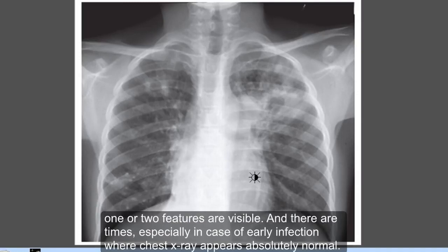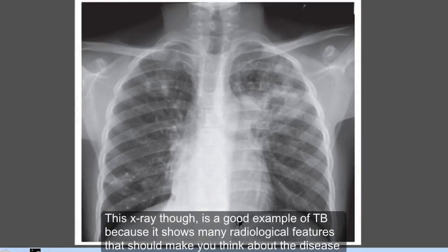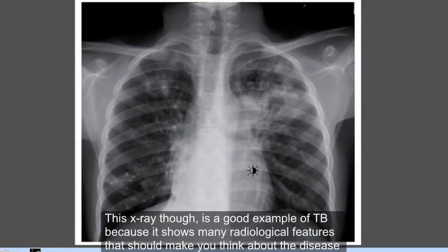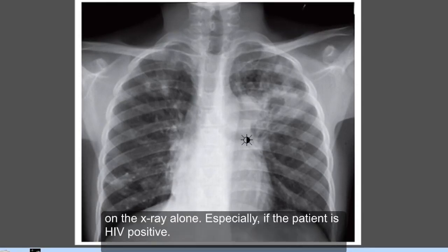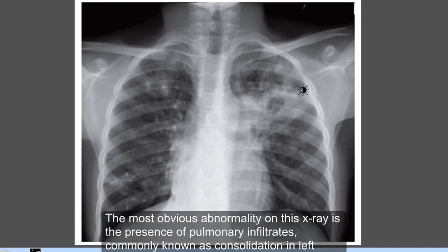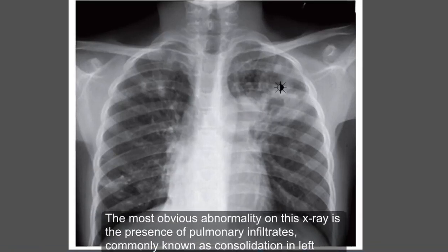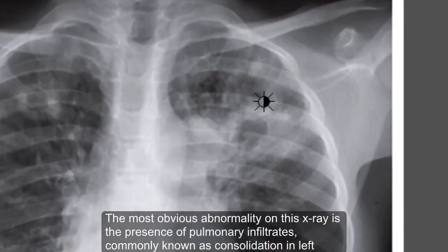Many times only one or two features are visible, and there are times — especially in the case of early infection — where the chest X-ray appears absolutely normal. This X-ray, though, is a good example of TB because it shows many radiological features that should make you think about the disease on the X-ray alone, especially if the patient is HIV positive.